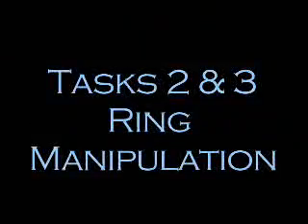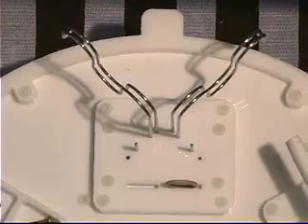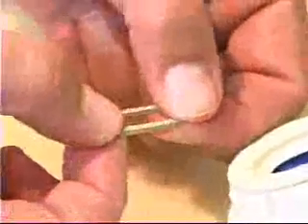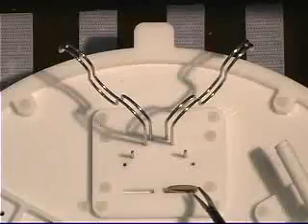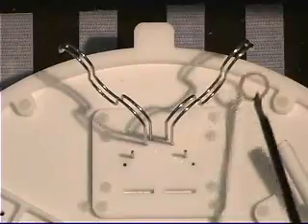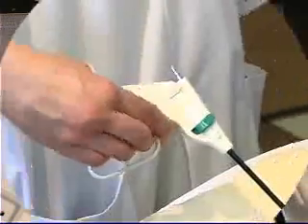Tasks 2 and 3, ring manipulation. This task is performed with a curved forcep and includes the conducting ring. The fragility of the conducting ring is demonstrated here, and extreme caution must be taken, especially when stretching the ring around the pin. The ring is picked up from the pod and guided over the metal post using twisting motions of the wrist. The goal is to have as little contact as possible with the post.